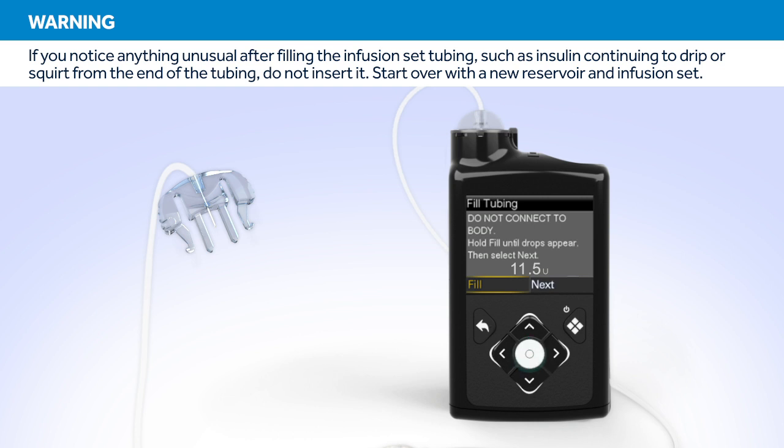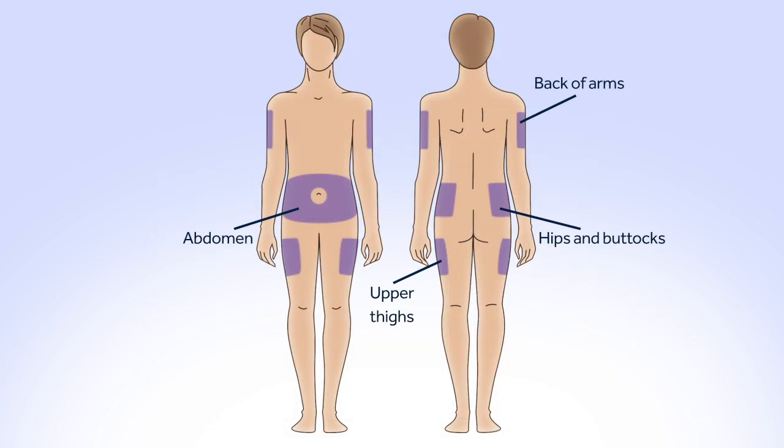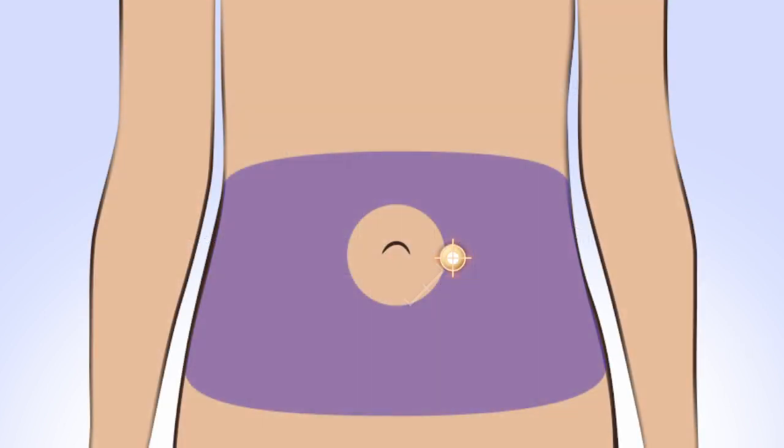Now press Right and select Next. Choose an insertion site from the shaded areas. Be sure to avoid the 2-inch area around your belly button, any hardened or scarred tissue, and the previous site you've used. If you give insulin repeatedly in the same area over a long period of time, it can cause the tissue to thicken and insulin won't be absorbed properly. Rotating your site is key to keeping your infusion sites healthy.